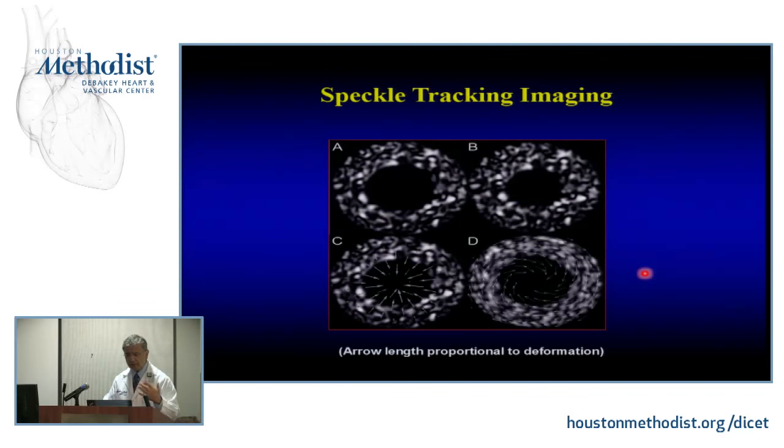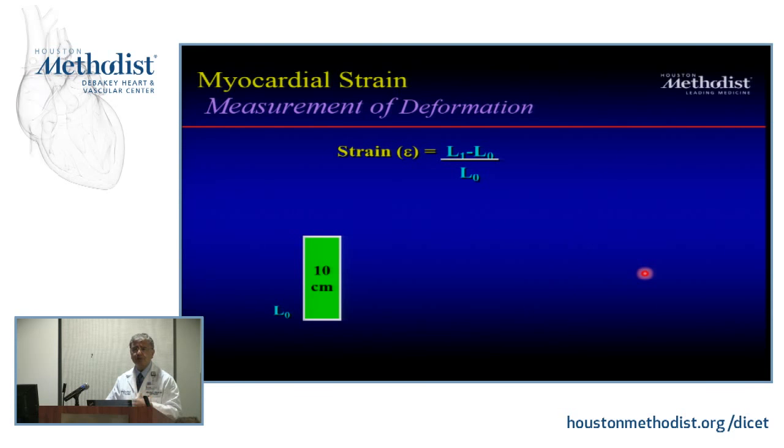You saw color Doppler. Speckle tracking is a different ballgame, another application. I attended the first presentation of this, and I think you're just like, wow, I was waiting for this to happen because your eye is following the speckles as opposed to the computer following the speckles, and now you could do so many things. It's not angle dependent, right? And from it comes strain and strain rate.